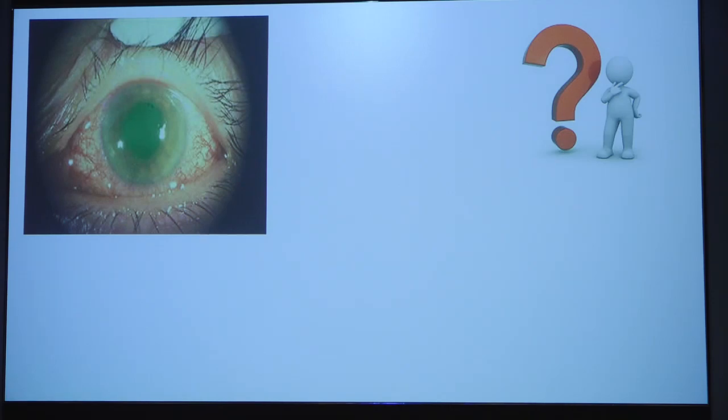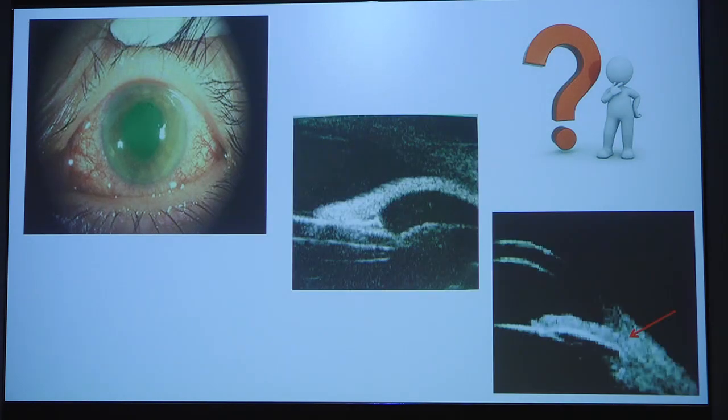Again, there are certain conditions where gonioscopy is not going to give you any information, for example in corneal edema, post intraocular pressure rise in acute angle closure glaucoma cases. Here again, doing a UBM would yield important information. You can see the typical iris bombé configuration, and here you can see the angle is totally closed with synechiae.